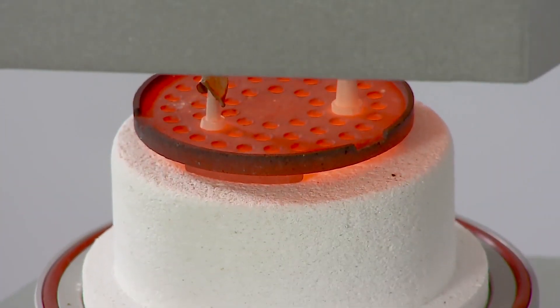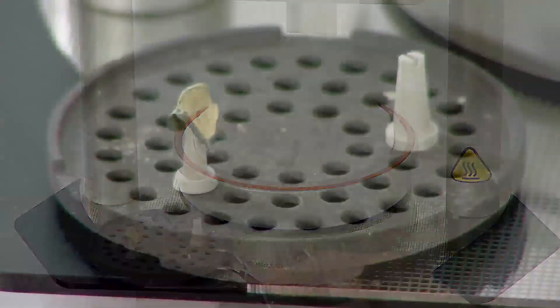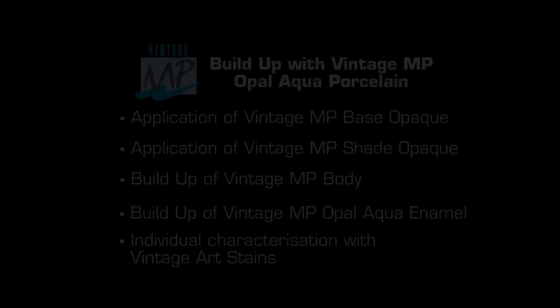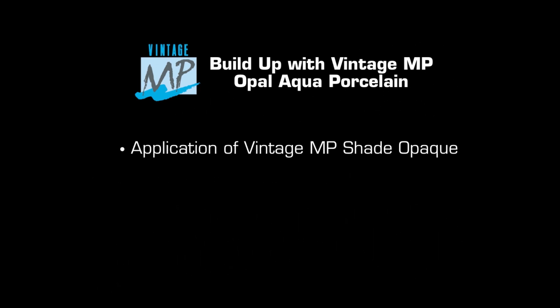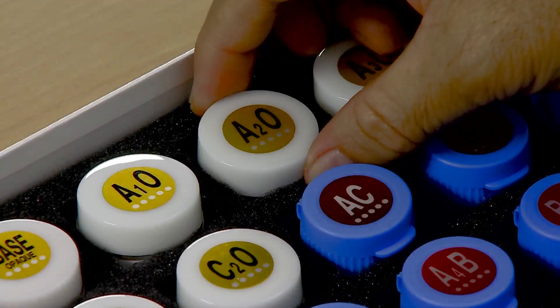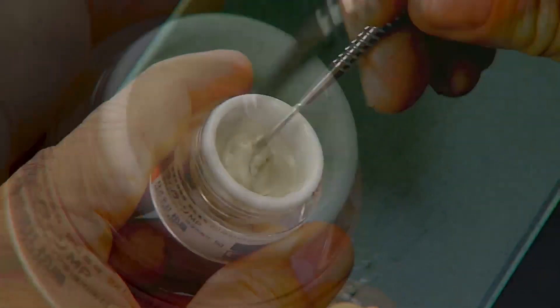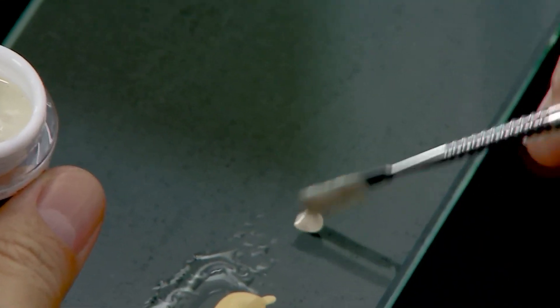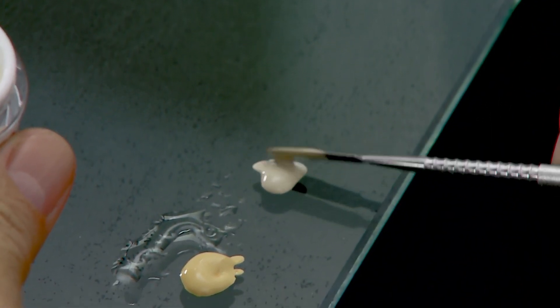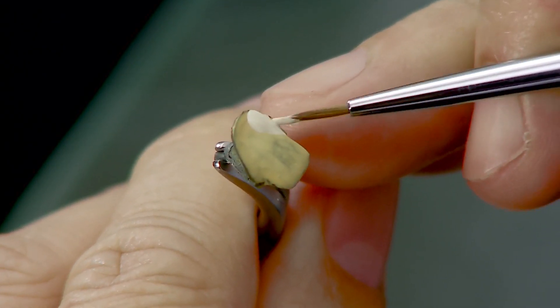Once the firing cycle is complete, remove the coping from the firing table and allow it to cool. Mix the Vintage MP shade opaque paste A2O in the same way as base opaque to obtain a homogeneous mix. Dispense an adequate amount of shade opaque onto the glass slab and apply a thin and uniform layer over the base opaque.